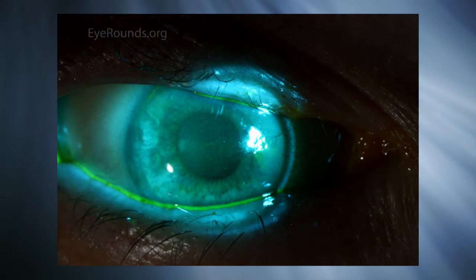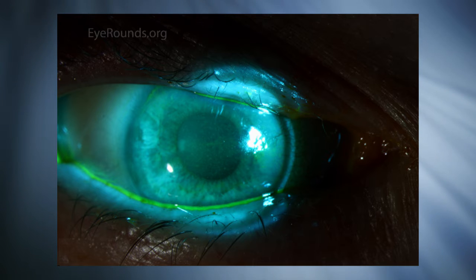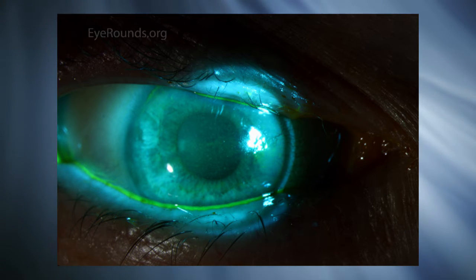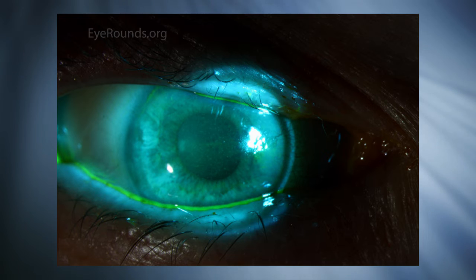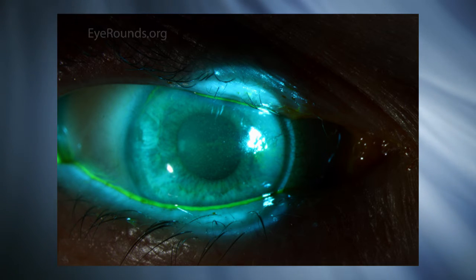Tear breakup test in a rabbit. In measuring tear breakup in a human, fluorescein is instilled into the patient's tear film, where the tear film is observed under a broad beam of cobalt blue illumination. The tear breakup test, or TBUT, is recorded as the number of seconds that elapse between the last blink and the appearance of the first dry spot in the tear film.